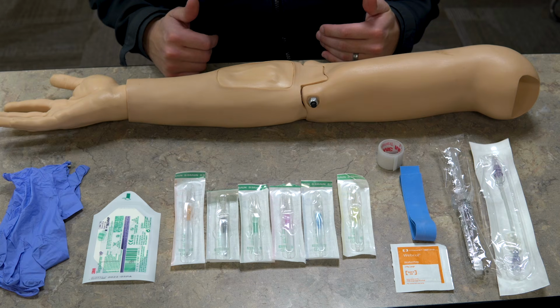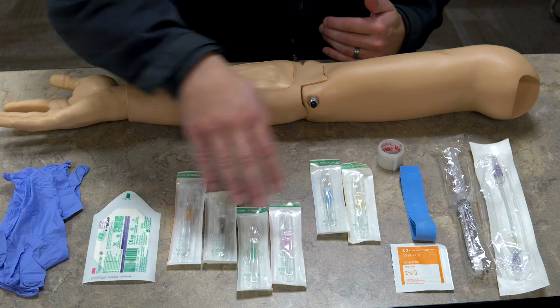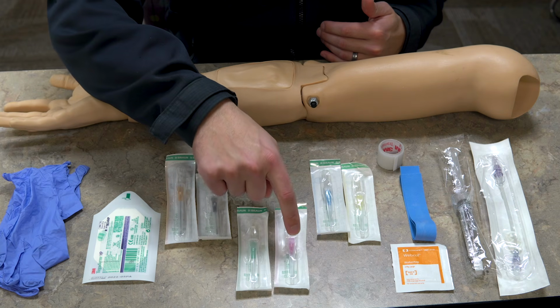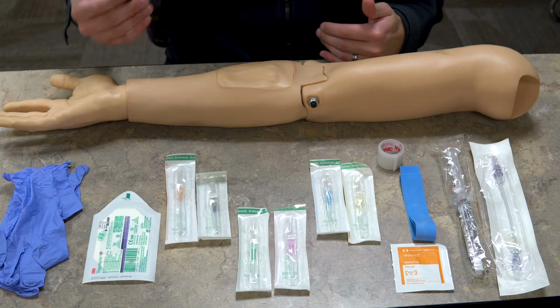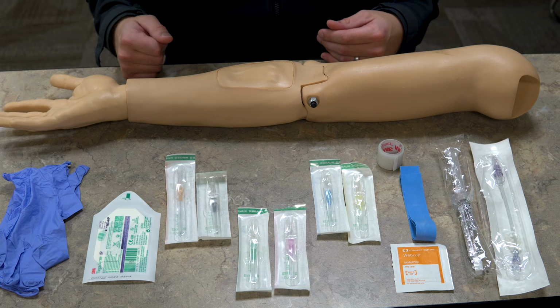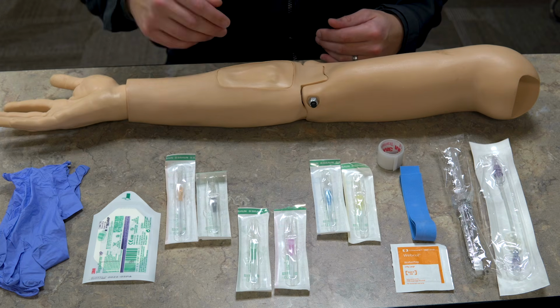Now, generally speaking, your 18 gauge and your 20 gauge are going to be your primary catheters that are used. So those are kind of universal colors. You've got pink and green, and that's how you know the size just off the bat. If you just look at the catheter, you can see what it is. Most medications can be given with these.